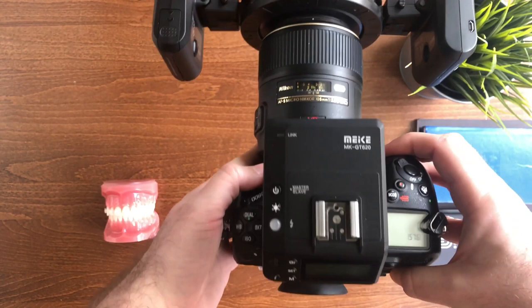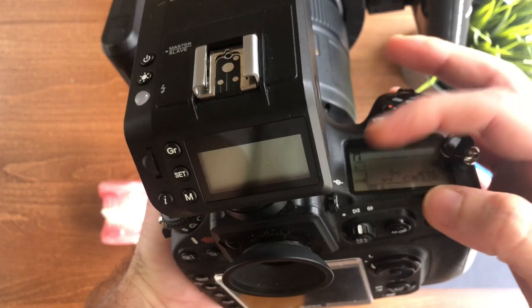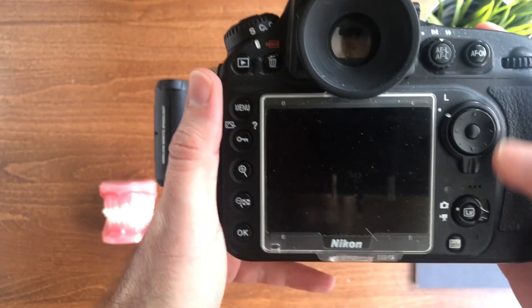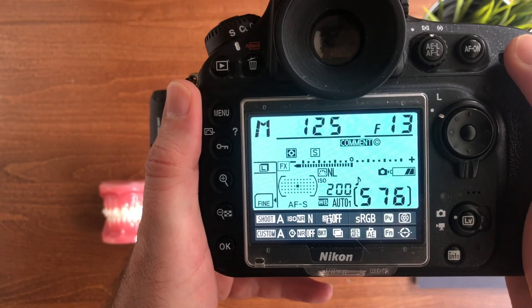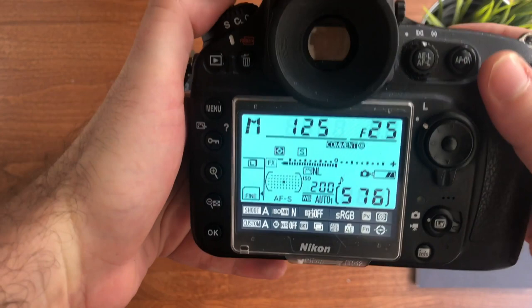When I first turn on the camera I will use it on manual mode. This might be a little bit confusing because you have a knob which you must put on M mode. I will show you the camera settings: I will use a shutter speed of 1/125 of a second, an aperture of f/25, and for the ISO I will use 200.